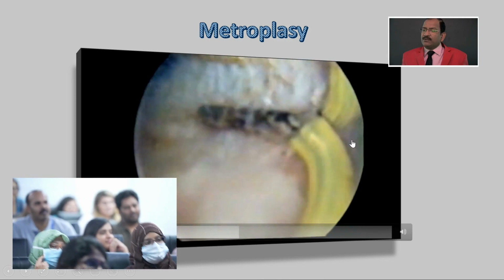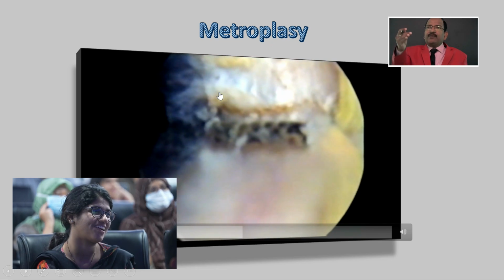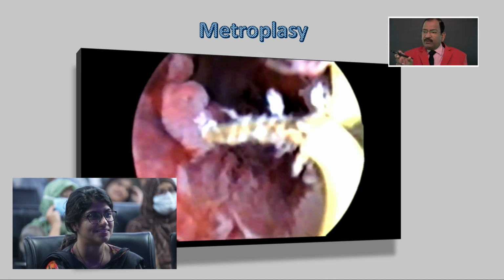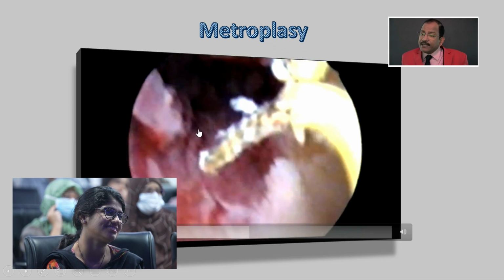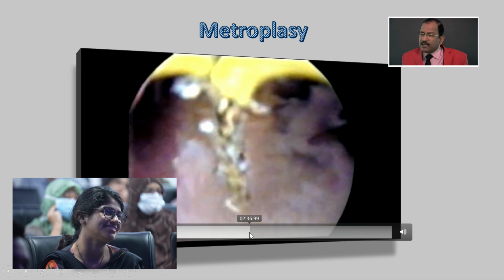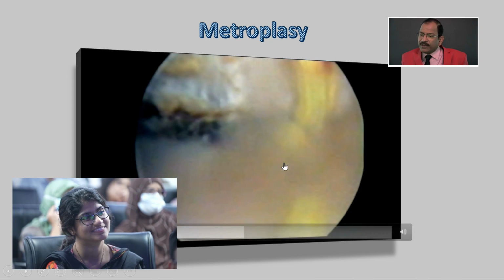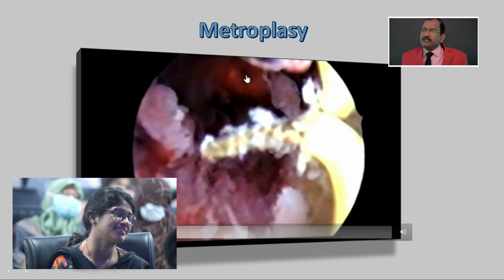So, this is slowly cutting. Here, once you reach near the fundus, you have to cut in steps, because it will be too thick for your Collins knife. See this light. This light is the laparoscope. It will be visible later also, but I will show you here. It is cutting, and this is the trans-illumination here.